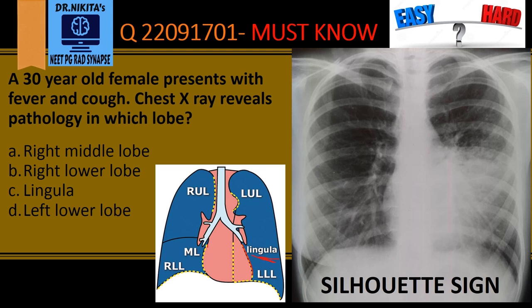Similarly, on the right side, if the right heart border is obscured, the pathology is in the right middle lobe. Here on the X-ray, the left heart border is obscured by this opacity, so the pathology is in the lingula. Therefore, the correct answer is lingula.